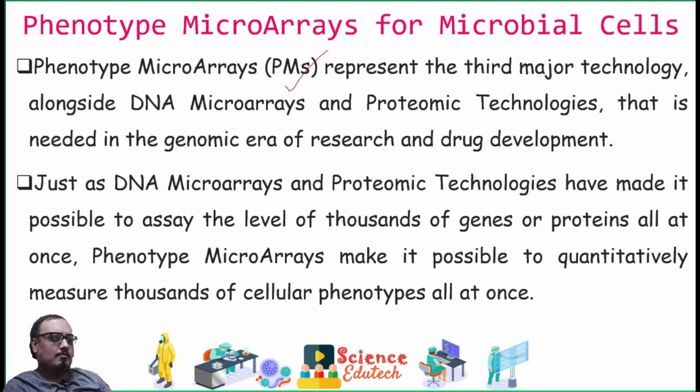Just as the DNA microarrays and the proteomic technologies have made it possible to assay the level of thousands of genes or proteins all at once, the phenotypic microarrays make it possible to quantitatively measure thousands of cellular phenotypes all at once. So this phenotypic microarray technology enables researchers to evaluate more than 2,900 phenotypes of microbial cells in a single experiment.